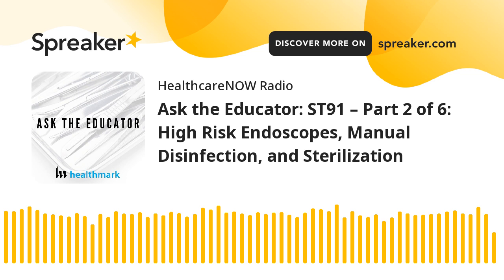And then we do have an annex within ST91 that walks you through how to figure out what that statistically significant portion of procedures may be. So if you're a high volume facility, it might be that you're testing every scope once a day. But if you're a low volume facility, you might still have to do every scope every time. So refer to that annex in the back of ST91 to help you figure out what that would be.